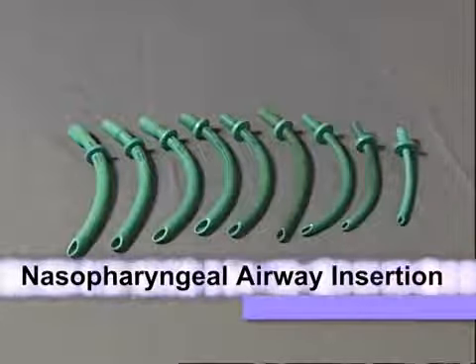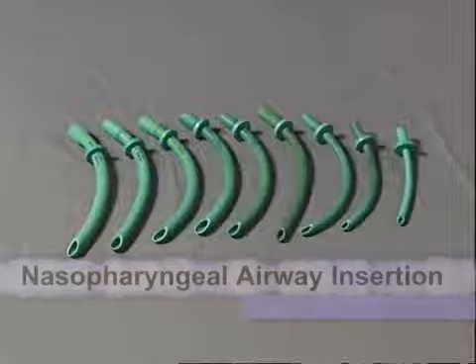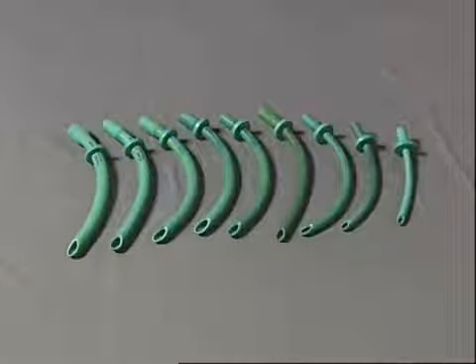Nasopharyngeal airways are simple to insert and can be used in both responsive and unresponsive patients. In instances where an oropharyngeal airway adjunct cannot be used, a nasopharyngeal airway may be a good option. Nasopharyngeal airways are produced in a variety of sizes to accommodate various patients.